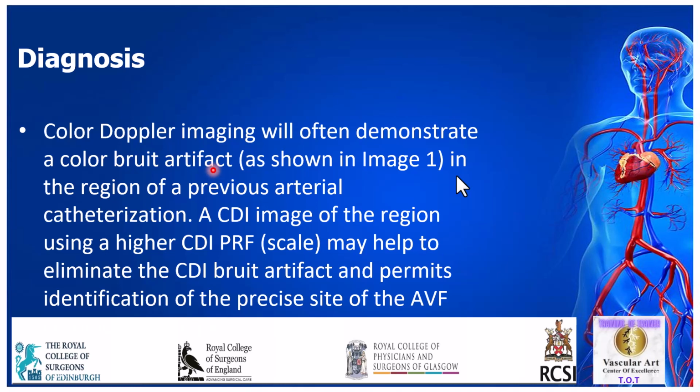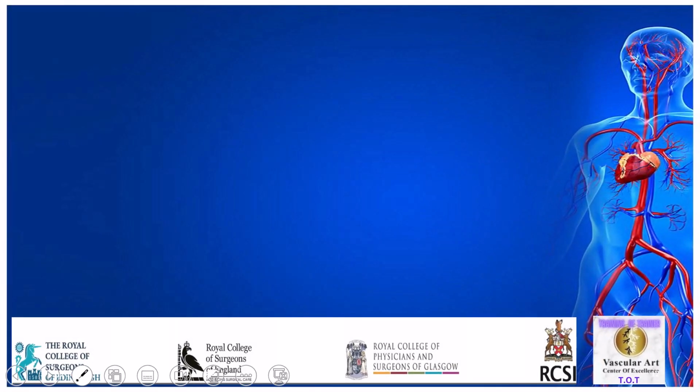Sometimes you need to increase the scale of your PRF in order to see more of the tissues, but it is difficult. Usually it is painful. If the patient has a dressing on the wound, you can change the dressing, put an Opsite, then put gel over the Opsite, and then you can do the duplex scan. Because this is important in the patient management.